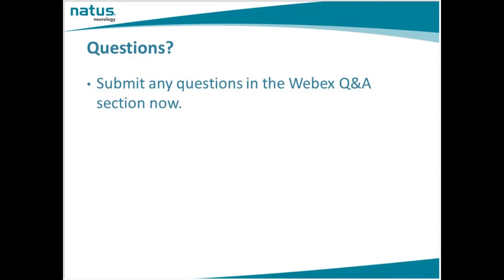Very good. And we've got one question that is not about your subject today. I will give it to you, and if you can comment, fine, and if you are not prepared for that, we'll just be fine. What causes could lead to normal TCD results, and on the same day the patient goes to CTA or angio, which shows vasospasm? Oh, well, vasospasm can occur very quickly.